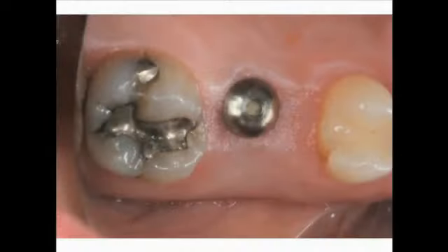Here we see the tissue healing around the healing abutment after 4 months of integration. The patient had no symptoms postoperatively and only took a Tylenol for discomfort the day of surgery. It is an amazing technique, an amazing surgery, and very, very well received by our patients.